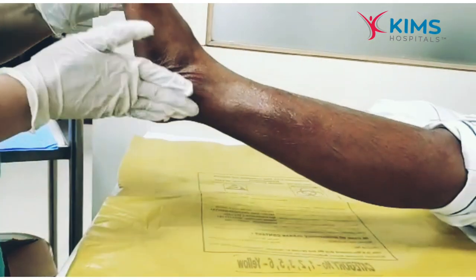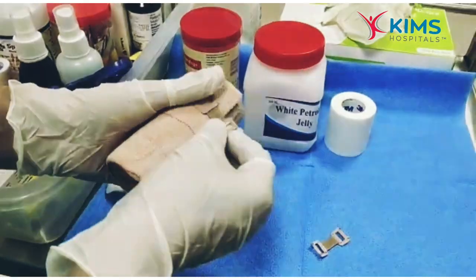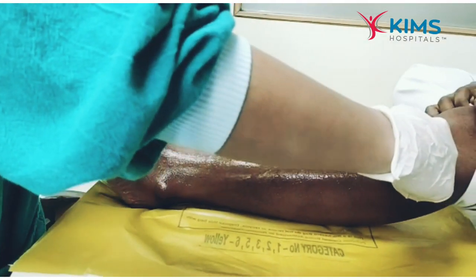It is advised to apply in the morning as soon as you get down from the bed. First, generously apply moisturizing cream to the foot and entire leg. Then take the crepe bandage roll and apply from the foot upwards to the leg, avoiding covering the toes.